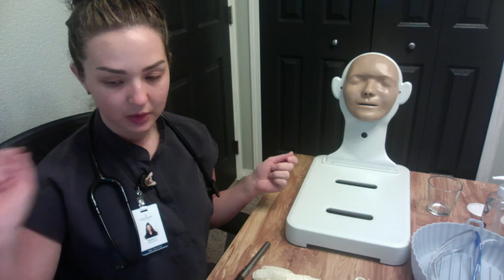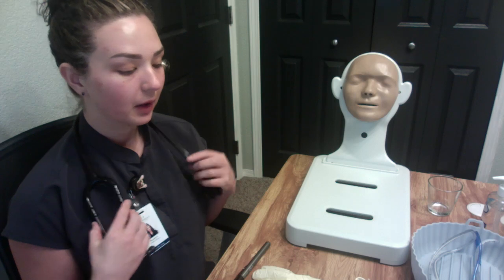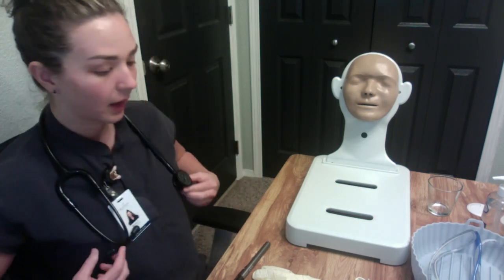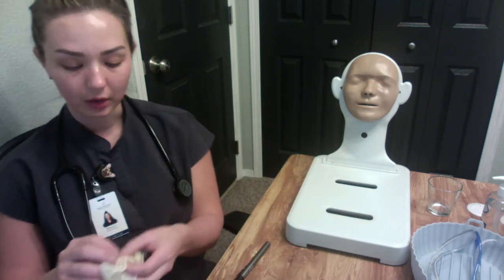Obviously, as we do this procedure, we want to make sure that we ensure patient privacy and comfortability. So, raising the head of the bed to high Fowler's if there's no contraindications. As we do this, bring them up, and then we'll put on our gloves and start with our procedure here.